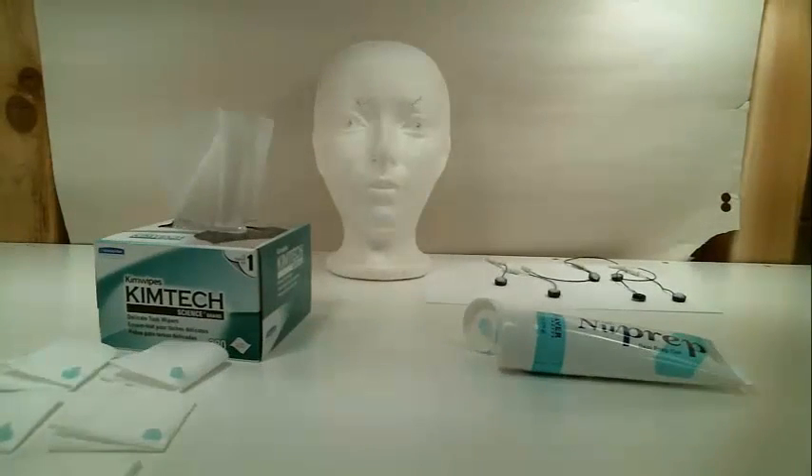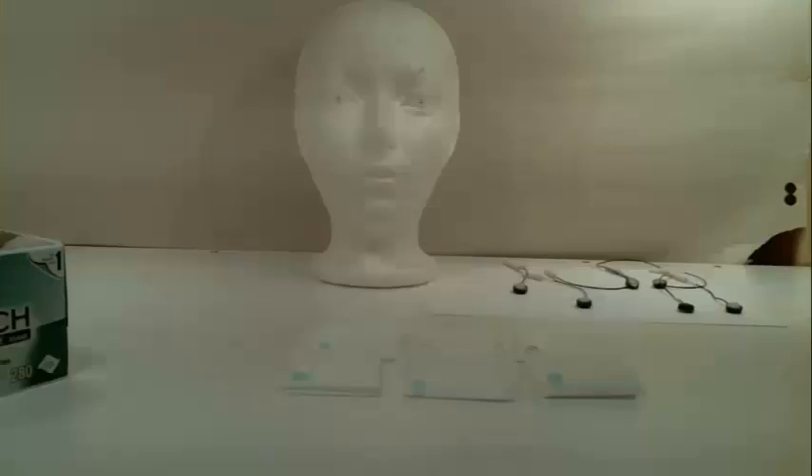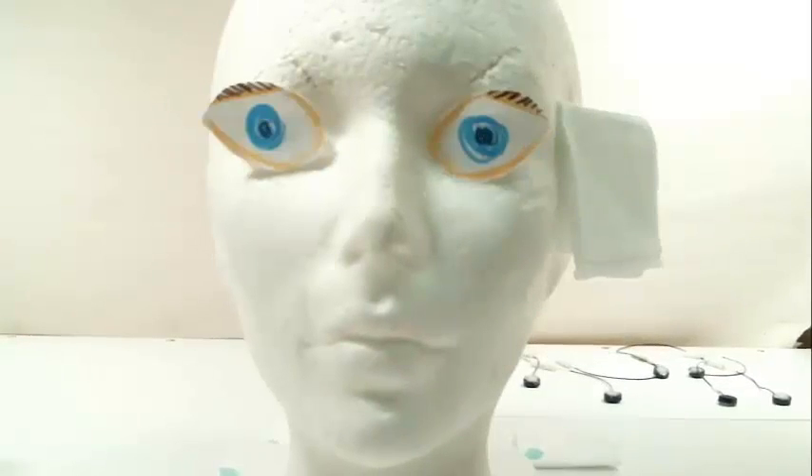Our eye electrodes are called electrooculogram, or EOG, and they measure electrical activity of the eye. The areas to be prepped are above and below the left eye, the right and left temples, and the mastoids. Make sure when you prep above and below the eye that you ask the participant to focus their pupil straight ahead. This way you will be sure to prep directly above and below the pupil, with electrodes in a straight line.